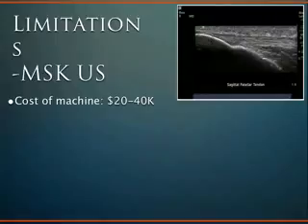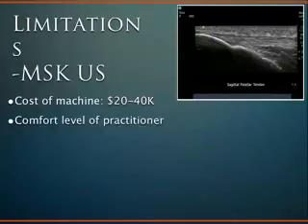In terms of limitations, though, certainly it can be expensive. These machines are not cheap, and if you're in a private practice or you're starting up a practice or even an academic situation, there is a significant investment to these machines. So there's a lot of front end costs, but in the end it can pay off in terms of the accessibility for the patient and accuracy of diagnosis and accuracy of procedures, injections. We'll talk a little bit more about that.